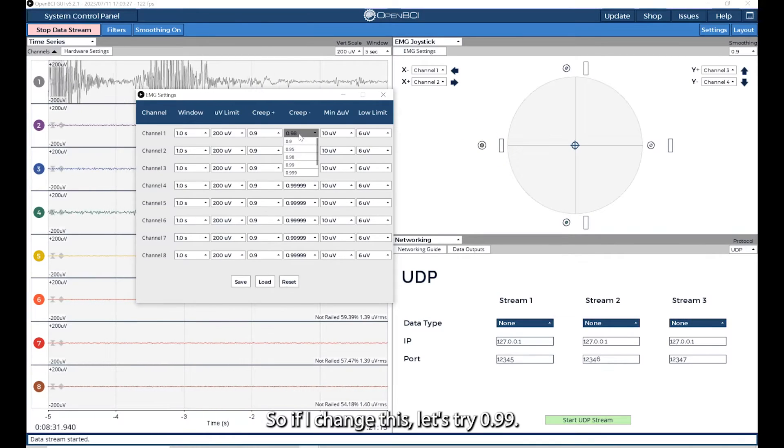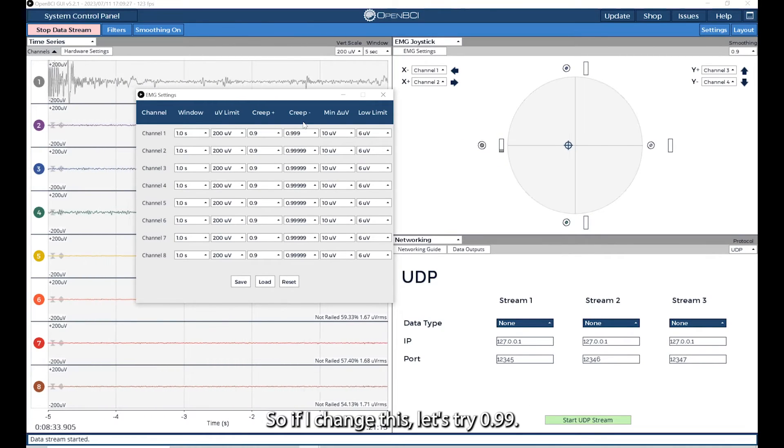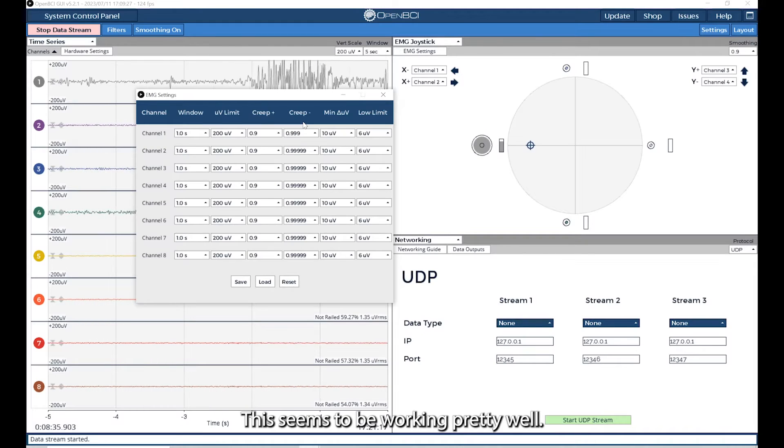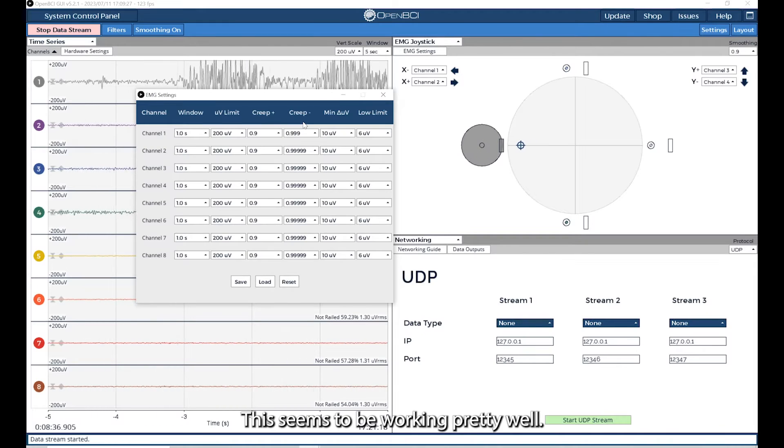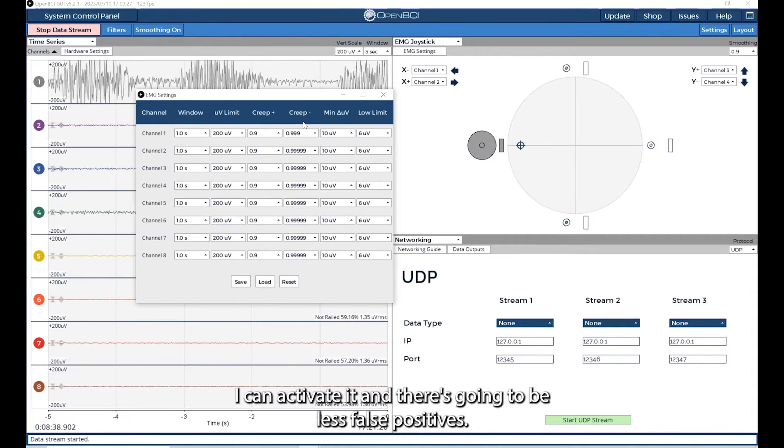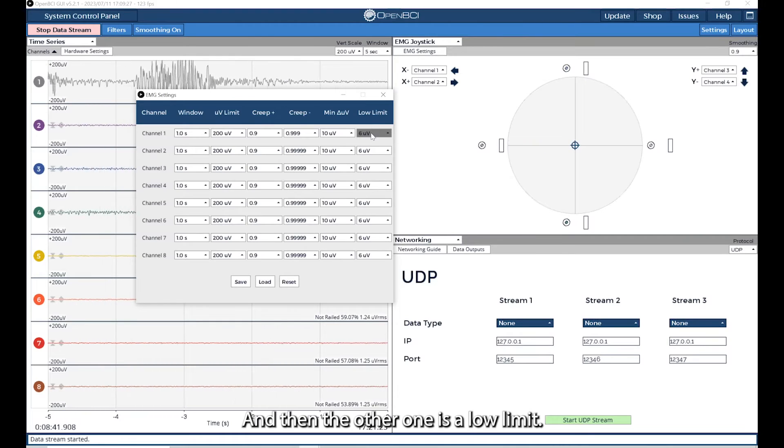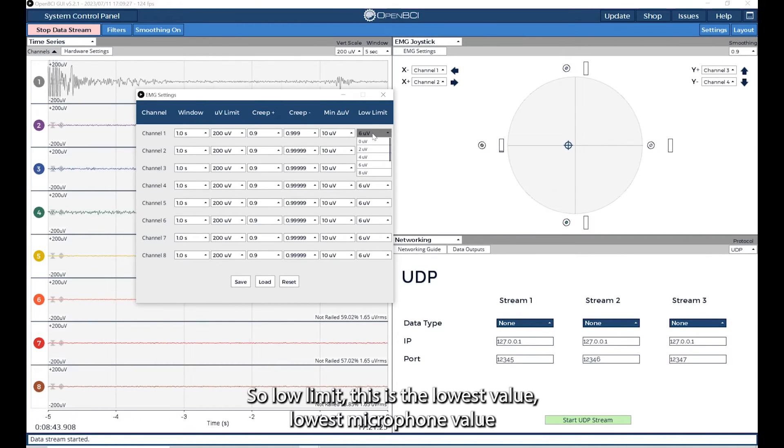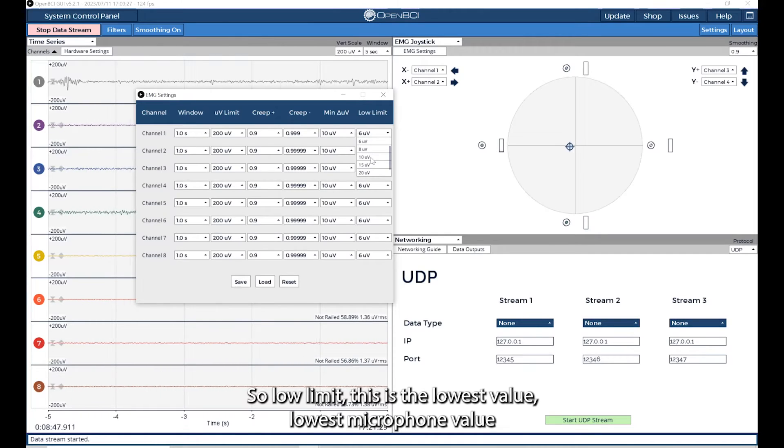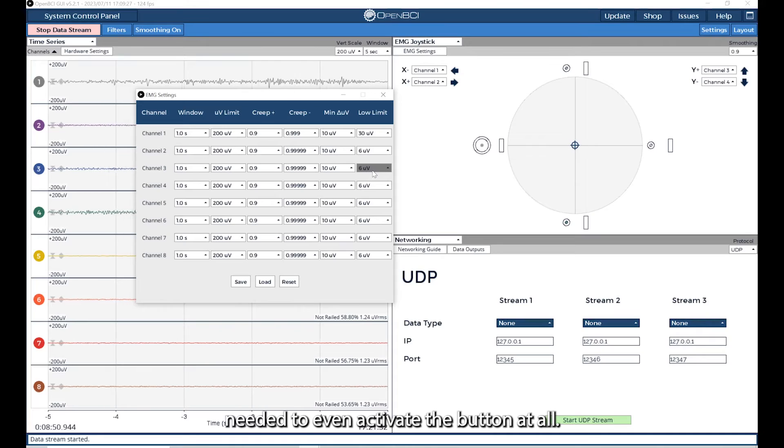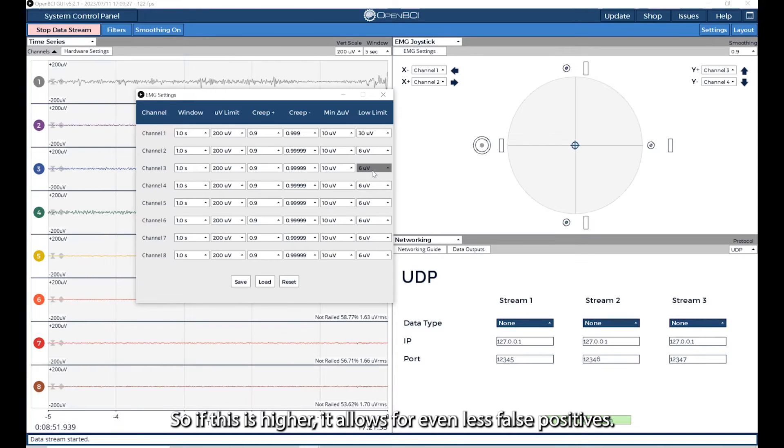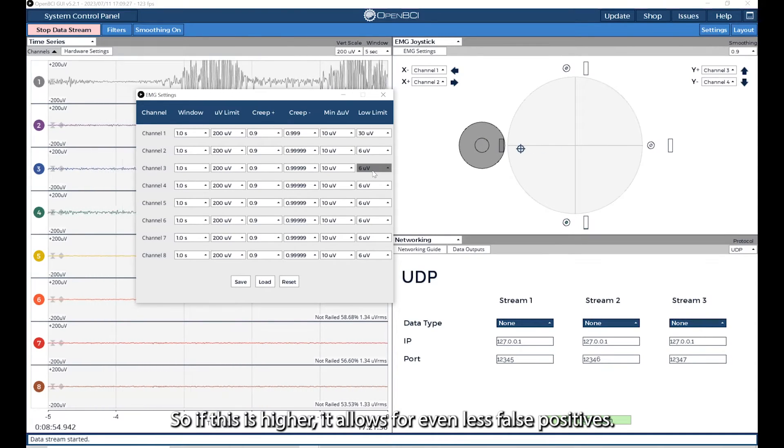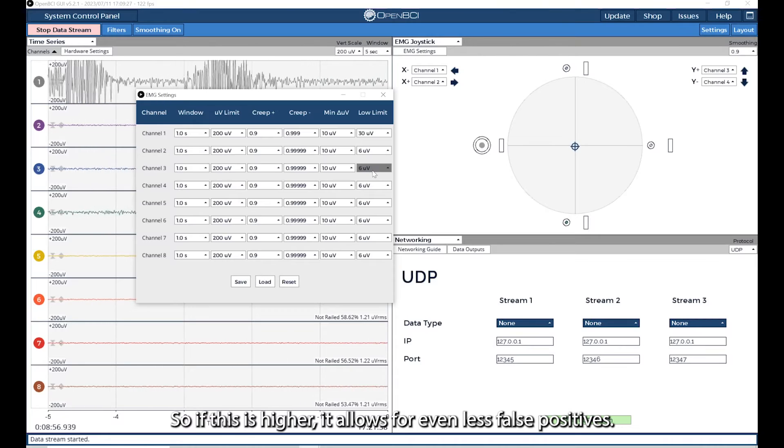And then the other one is low limit. Low limit is the lowest value, lowest microvolt value needed to even activate the button at all. So if this is higher, it allows for even less false positives. Each person is different, and you're going to need to play around to see which settings work best for you.